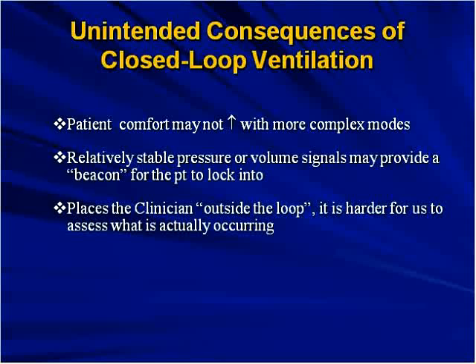If you have an inspiratory time that's too long, particularly at a high respiratory rate, it's going to prevent the lung from emptying. So setting I times, we typically use inspiratory times in controlled ventilation, or in assist controlled ventilation, of about 0.7 to 0.8 seconds in patients with obstructive lung disease to get an IE ratio of about 1 to 5 or greater. In a spontaneous mode, this is really, really important.